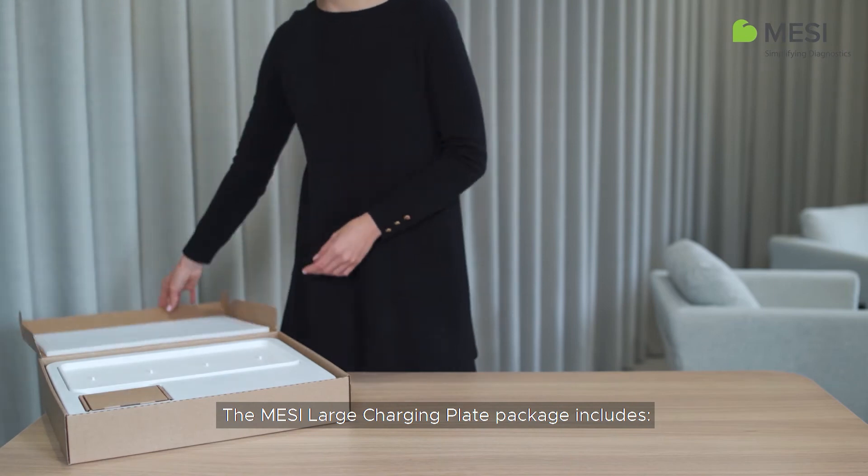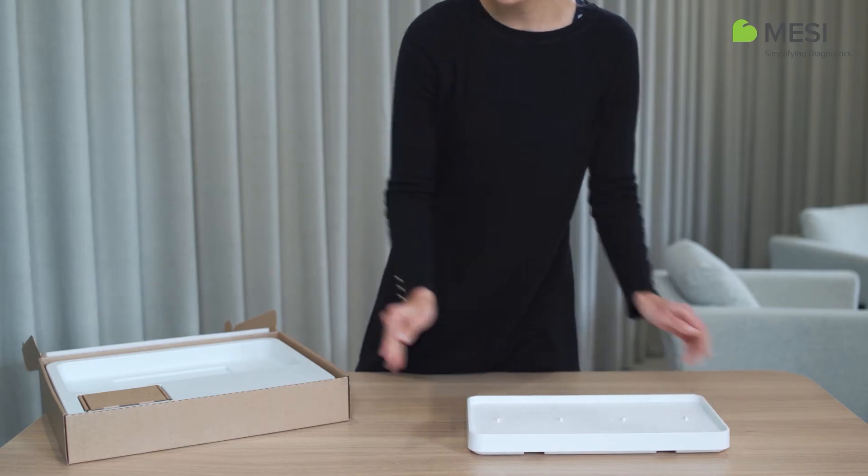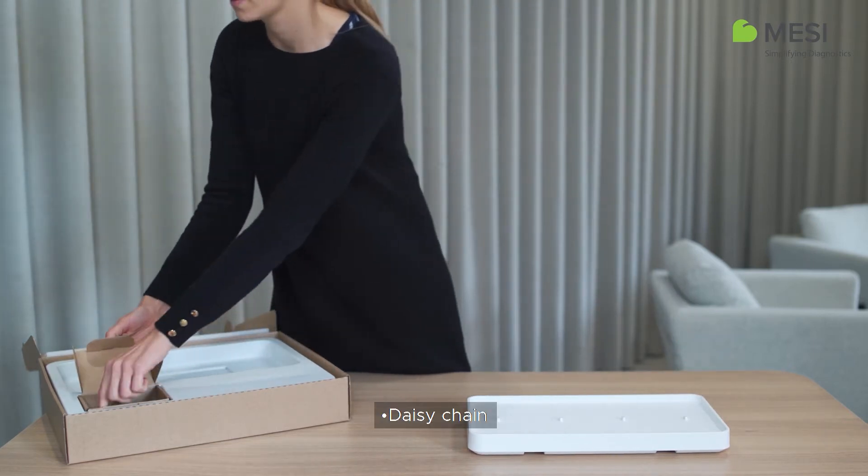The MESI large charging plate package includes a 4-port charging station unit and a daisy chain.